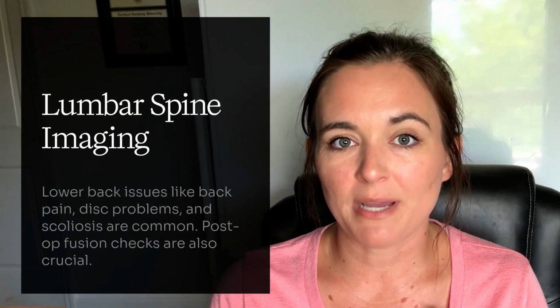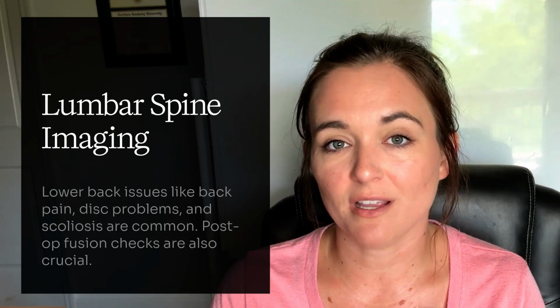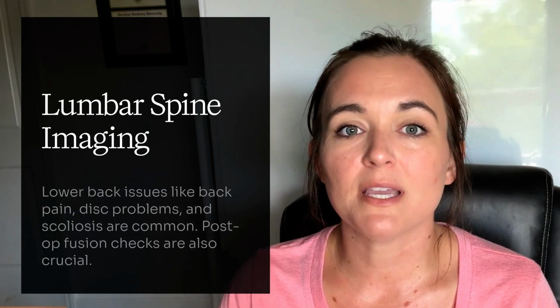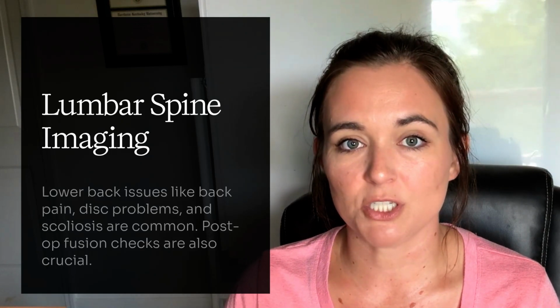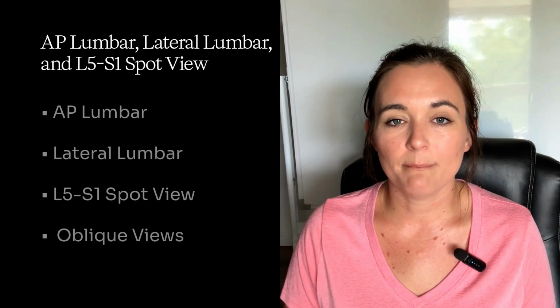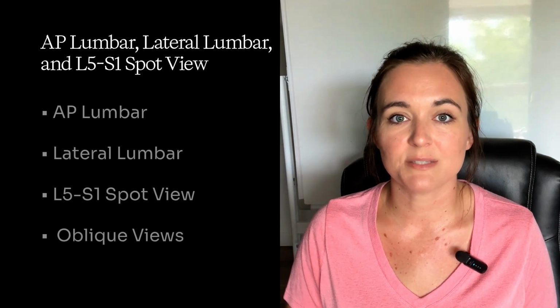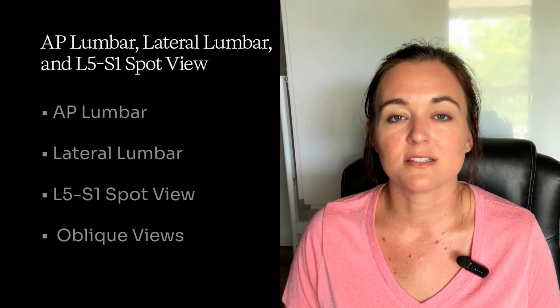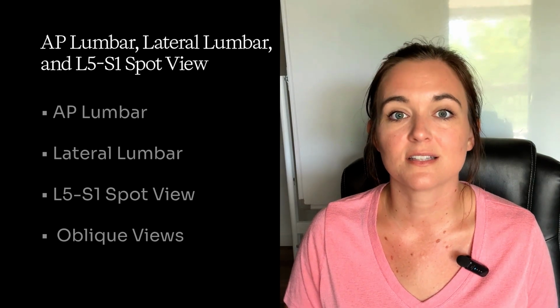Let's break down the lumbar spine. This is your lower back, and it gets a ton of attention in radiology. Whether it's for back pain, disc issues, scoliosis, or post-op fusion checks, the L-spine is the moneymaker of spine imaging. We're going to walk through AP lumbar, lateral lumbar, L5-S1 spot, aka the lumbosacral junction view, and the obliques with the classic Scotty dog appearance. Let's start with the AP.